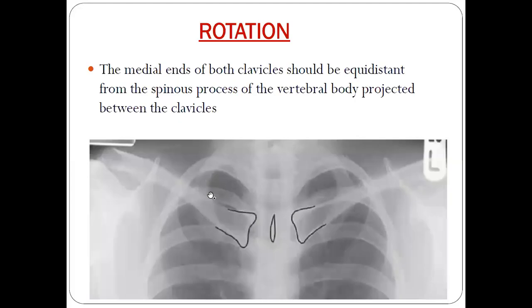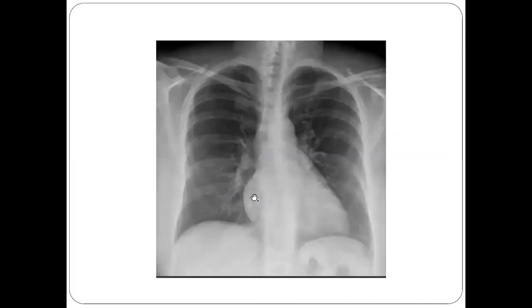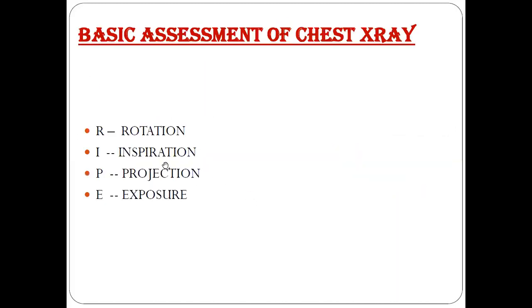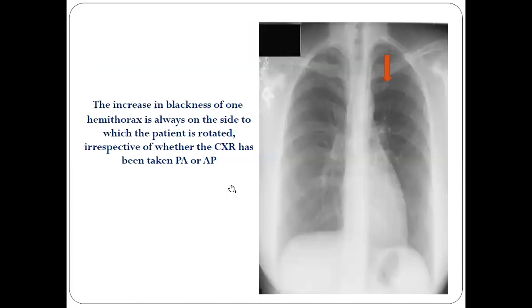To summarize rotation: the main thing to remember is the spinous process and the distance between the spinous process and the medial end of the clavicle. In coming videos, we will also be talking about inspiration, projection, and exposure of an x-ray.